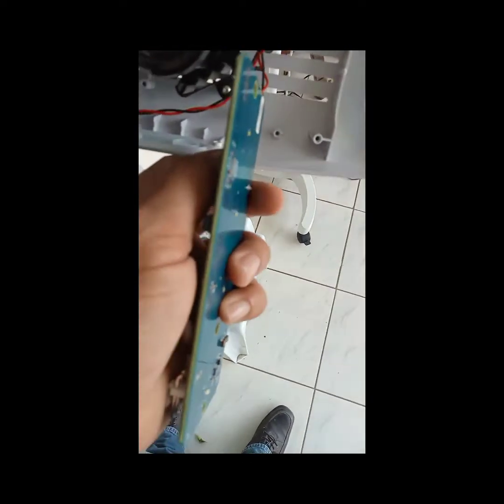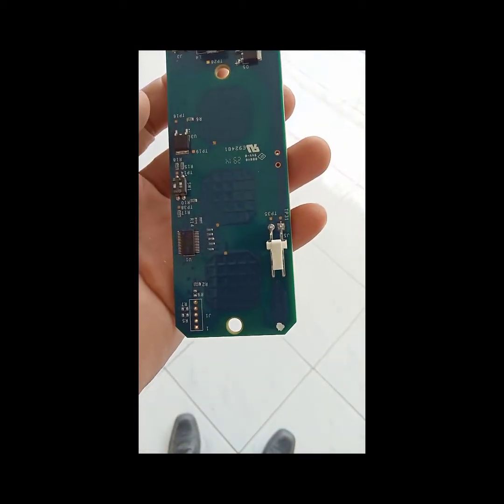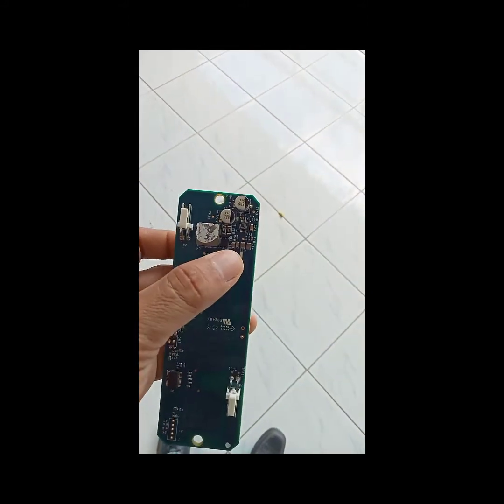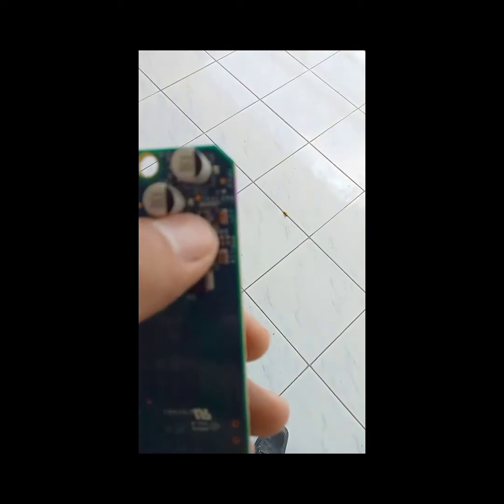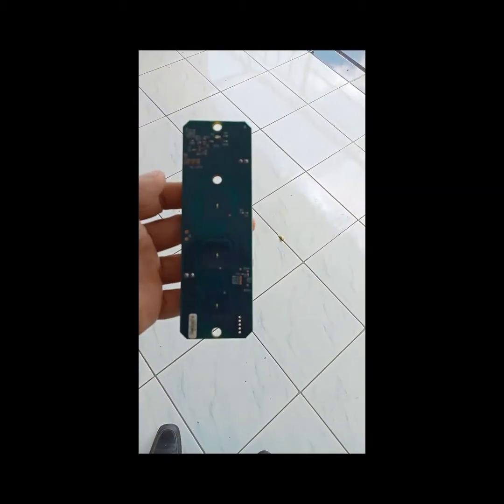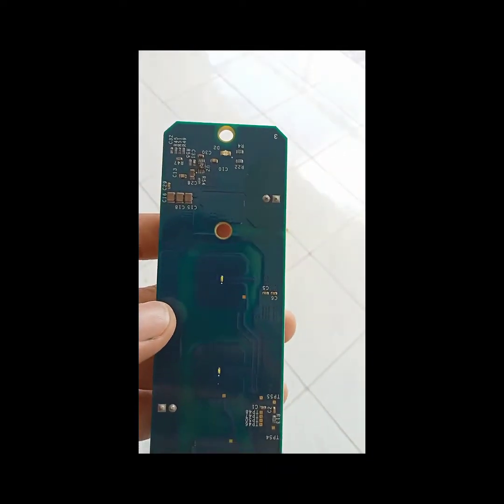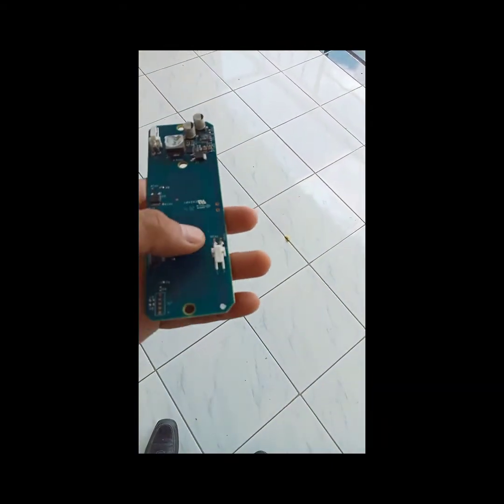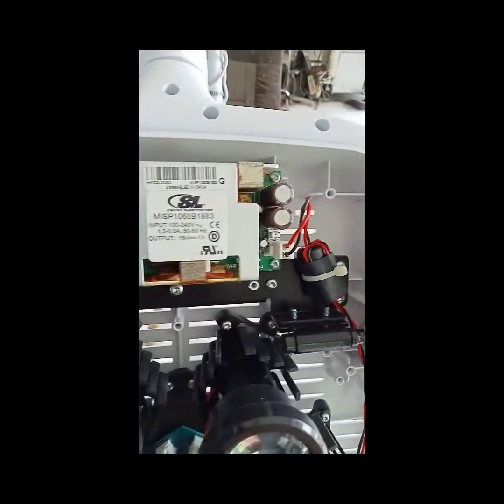We're going to check all the components here and we're going to Google the IC part and check its output. Here are the capacitors, resistors, and here is the IC sensor right here. We're also going to try to check the connections and the wires — maybe it's also the culprit. So we're going to check it out.